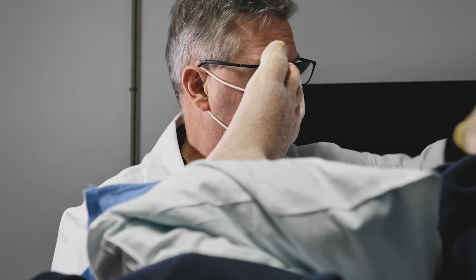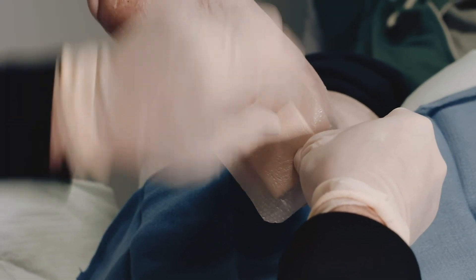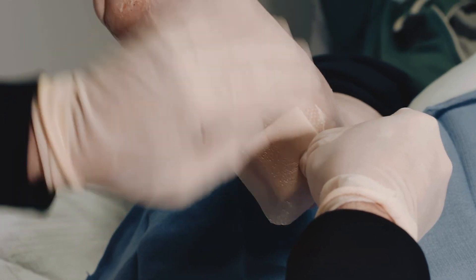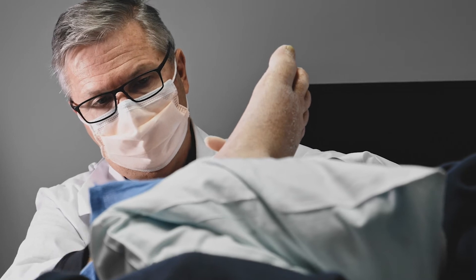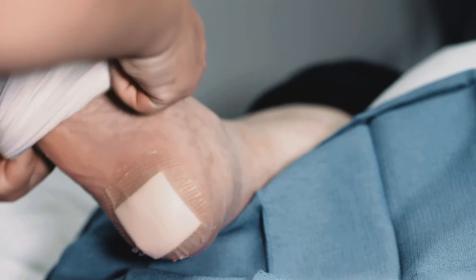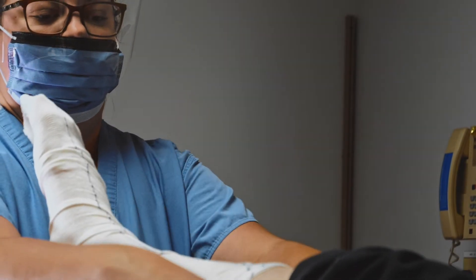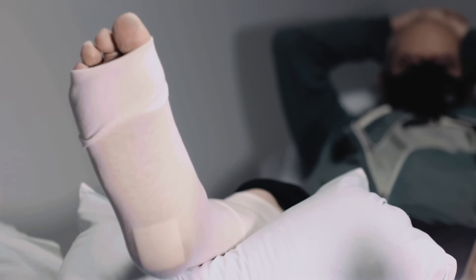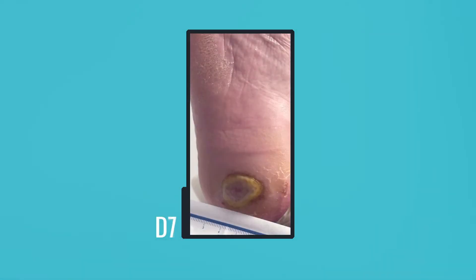The aftercare for Dermagen is pretty straightforward. The best secondary dressings provide a non-adherent layer and promote moisture balance — for example, a Mepilex Border. Too much moisture will cause maceration. A dry gauze wrapping around the dressing is recommended; this should add slight pressure to the wound site in order to prevent movement of the graft during the first one or two weeks of healing.